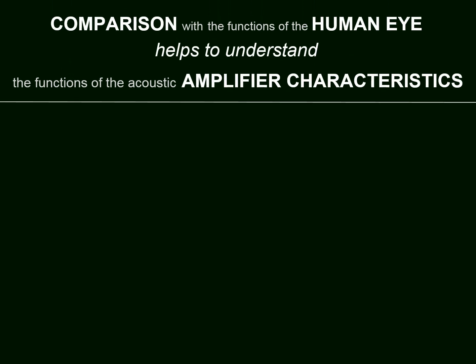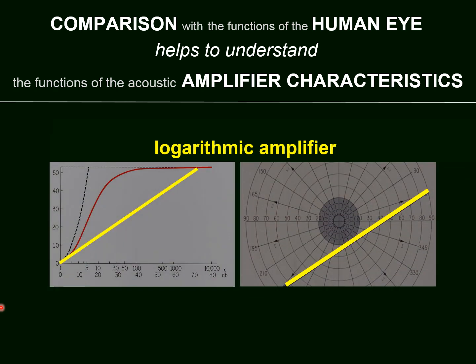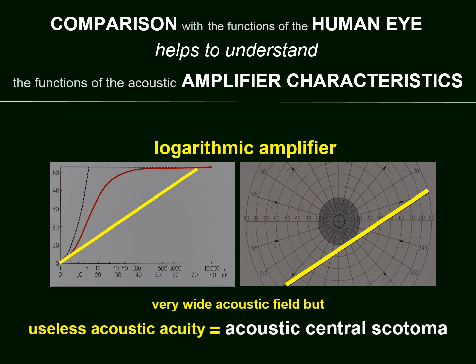With the functions of the human eye, the functions of the logarithmic amplifier are seen here. Yes, no problem with the field, but there is a central scotoma, an acoustic central scotoma. The sensitivity is not good enough.